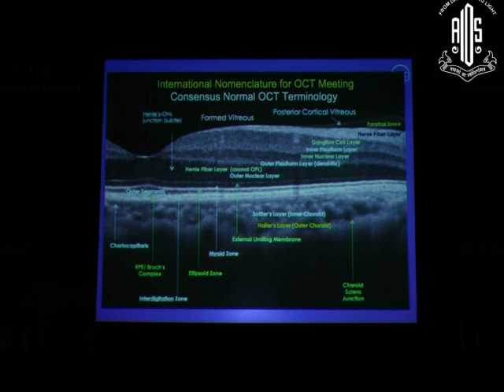So what are we looking at in the choroid right now? If you look at the histological layers, there are 3 layers in the choroid. You see a thin dark band there, that's the choriocapillaris. The next layer is the layer of Sattler, the inner choroid with smaller caliber vessels, which are the dark round structures there.